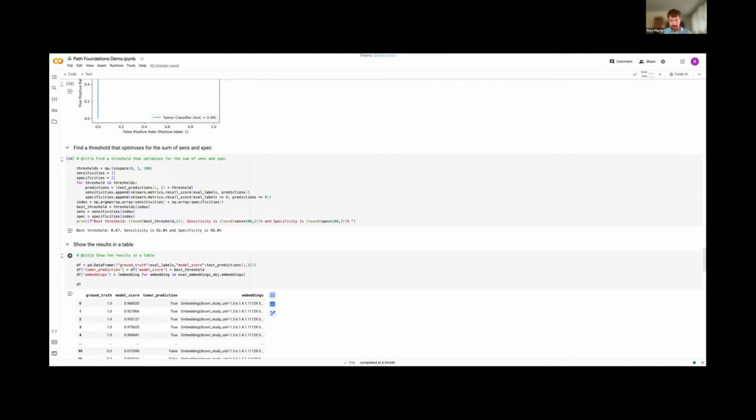But you don't have to just do cancer stuff. You can do, is there tissue in this patch? That might be something interesting for you. You maybe want to classify what kind of tissue type it is. Is it prostate tissue, cervical tissue, lung tissue? That might be interesting. People have been interested in looking at more operational applications.